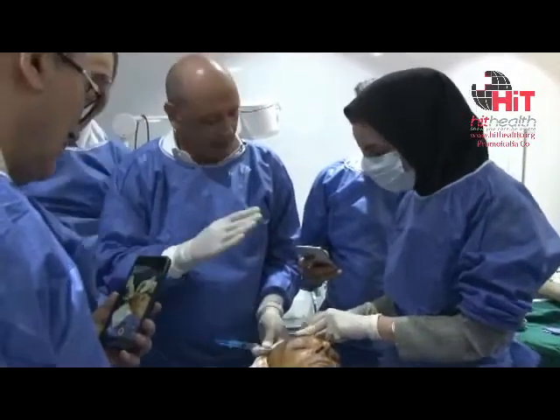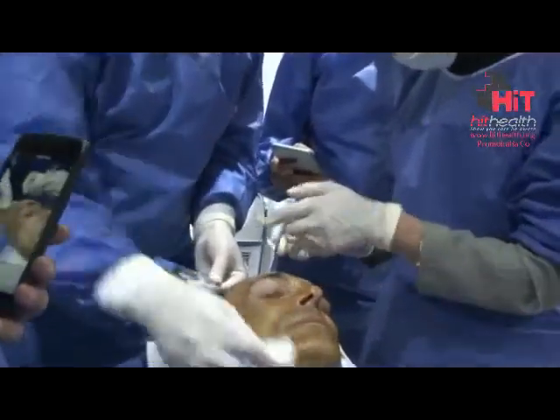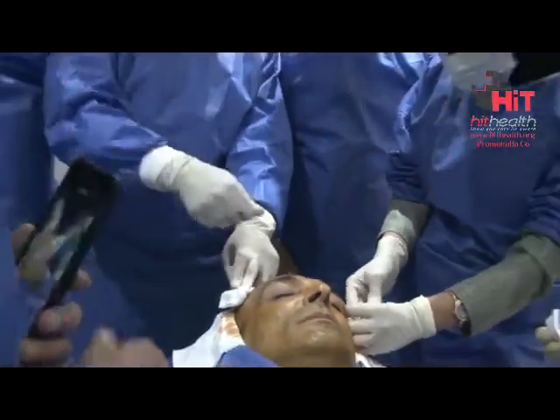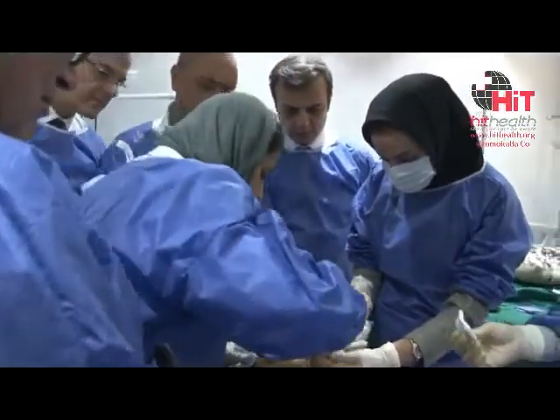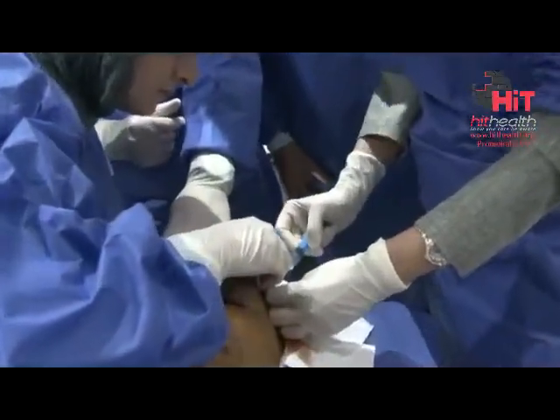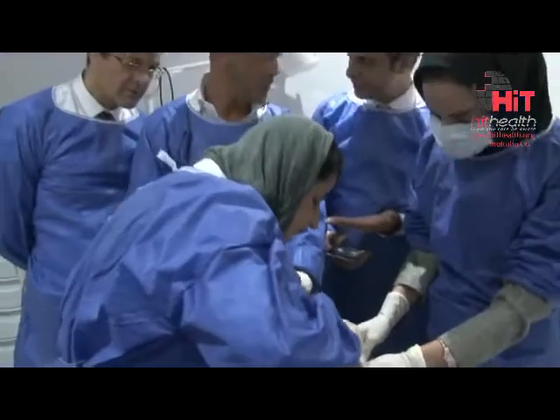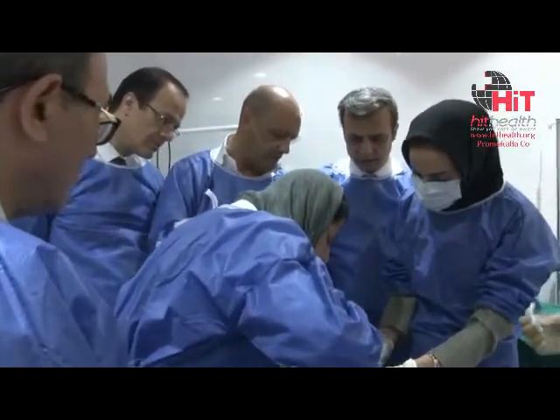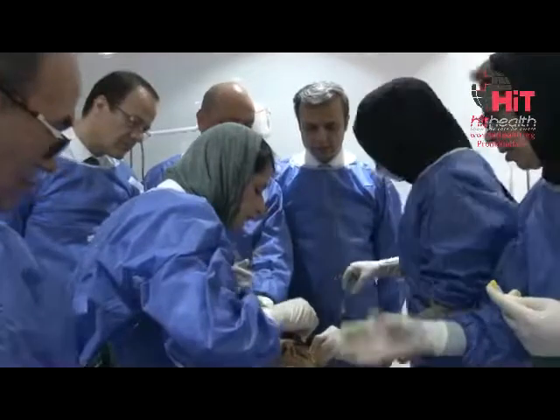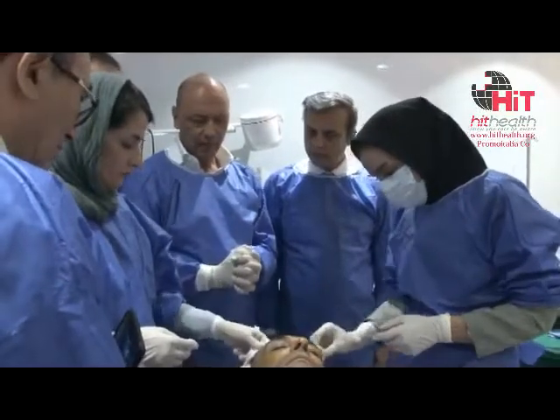And these lines — I stay, look, it's broken. You can try on the second one. Now go under — the periosteum is dissected. A little dissection. There is a hole in it — bone. Simple. Wait one minute. In this way it works very well — local anesthetic — and after we can start.